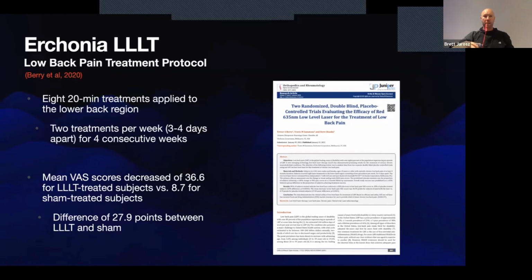So basically, the other choice that we have with this, as we may be able to see across my body, is if I have that 10 centimeters, but if I wanted to cover my whole trunk, I can of course move this out to be able to have that being the full length of my trunk. So we could do this for the lower back. So if we said my chest here is my lower back, I could set that to my chest, and then I can just keep that perpendicular, and I can just wand this across my lower back. So I'm pointing and shooting. I'm not doing much else except just covering the area that I want to treat.